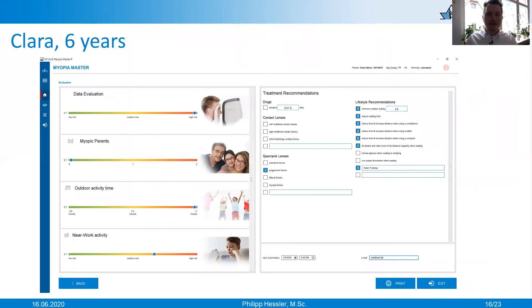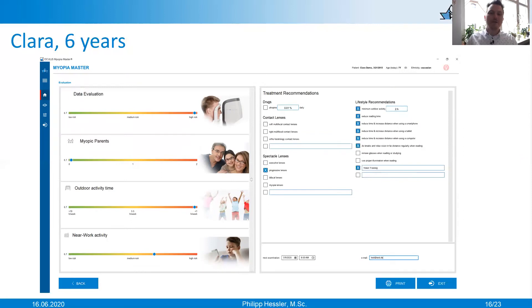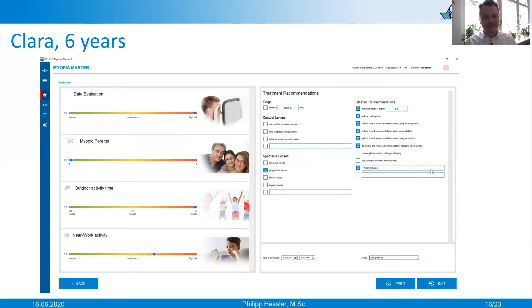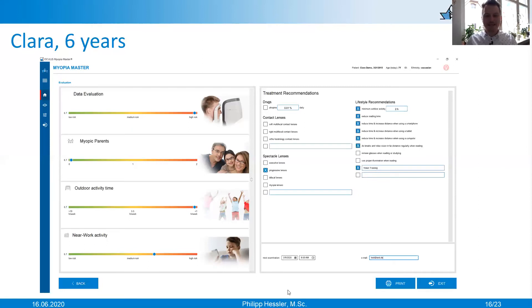The last display of the PC software deals with recommendations. What are we going to do with little Clara? We can hardly offer her orthokeratology contact lenses in this case. Now, Clara has problems with accommodation — her accommodation amplitude was five to six diopters, and that's not good enough for her age. The associated effort in near work could promote the development of myopia. That's why we're going to give her a plus lens add to help with accommodation. We also recommend, of course, the soft factors: more outdoor activity, less reading time, reading distance should be higher, and so on. I can enter the next examination date here below, which can be sent as an iCal file directly by email. I can also create a myopia report, which I can either print out or send by email.